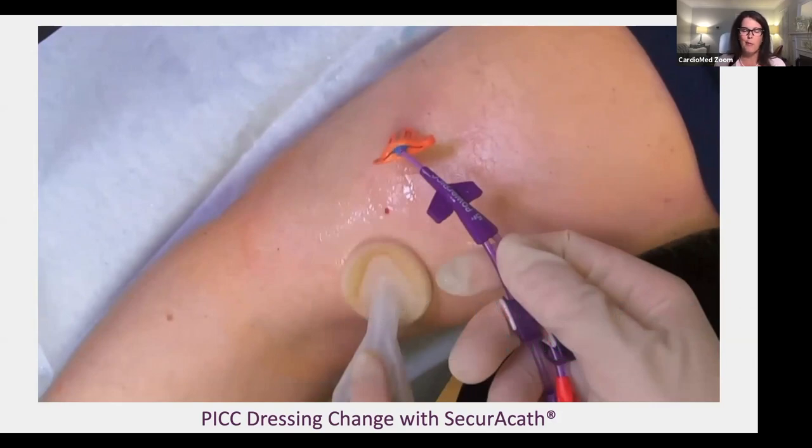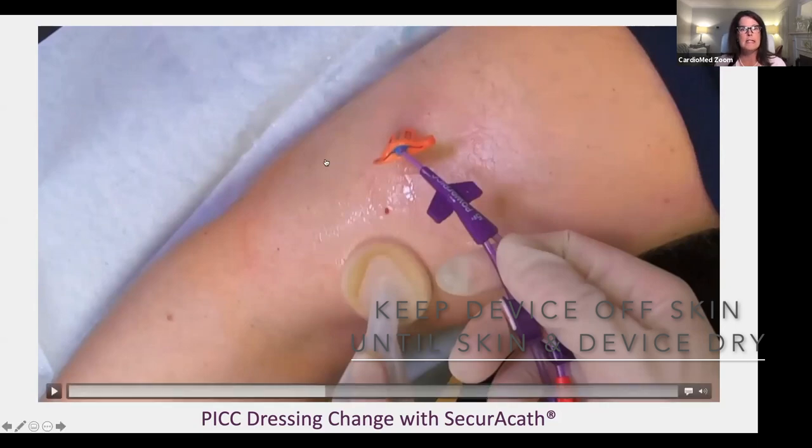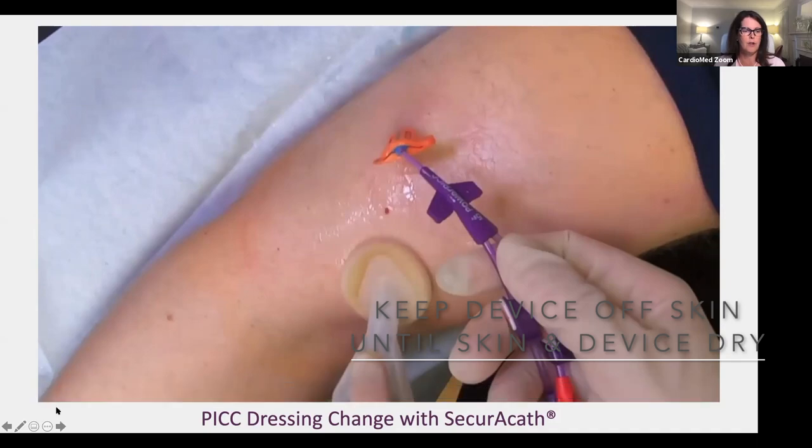Just another tip, when you're scrubbing the skin, you are using a back and forth motion, up and down and sideways to get all those nooks and crannies, and you're using friction. And then of course you must let that solution dry so that you don't end up with any skin injuries, which Michelle is going to speak to in just a moment. So lift it straight up and clean well under there, and then let it dry.